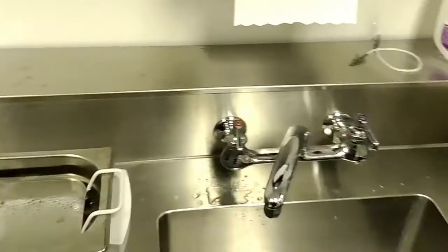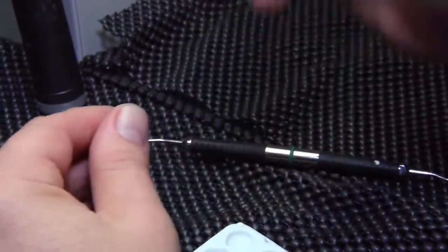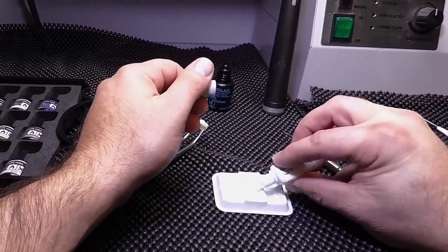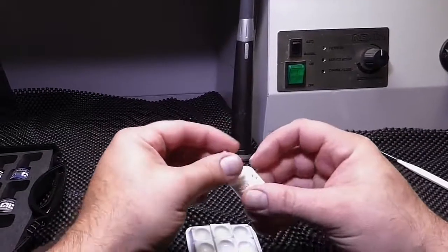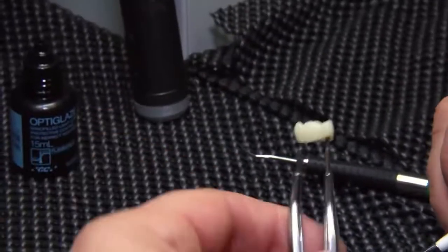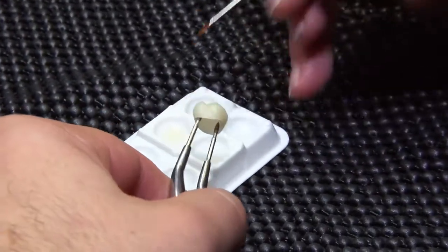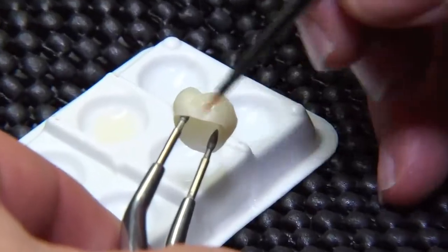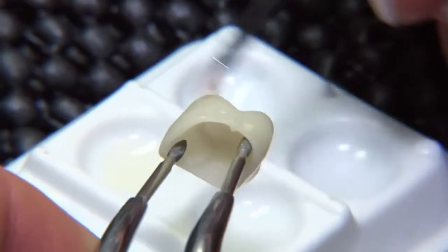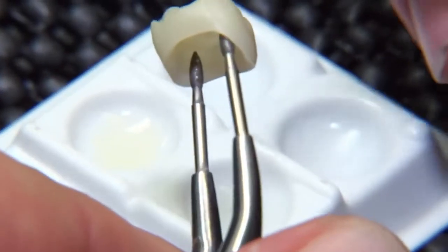Now we're going to be ready for the OptiGlaze. The next step is to take the Ceramic Primer 2 and add a little bit into our well. These little pallets and the brush both come in the OptiGlaze color kit. We apply the Ceramic Primer 2 all over the surface of the restoration — just a very nice thin layer. This creates a bond between the OptiGlaze color and the Sarismart.